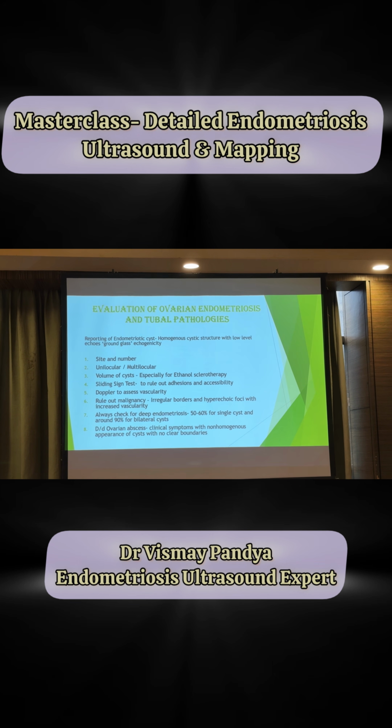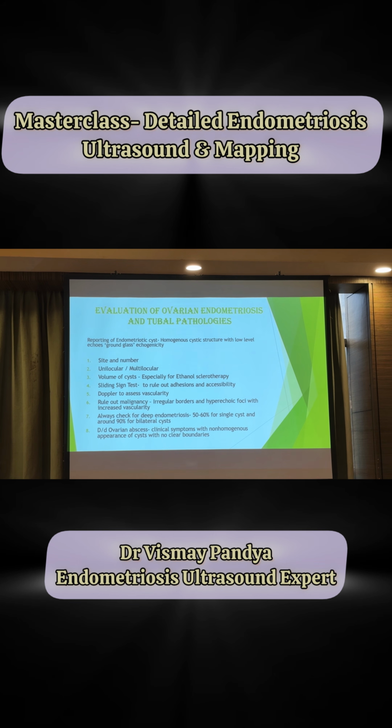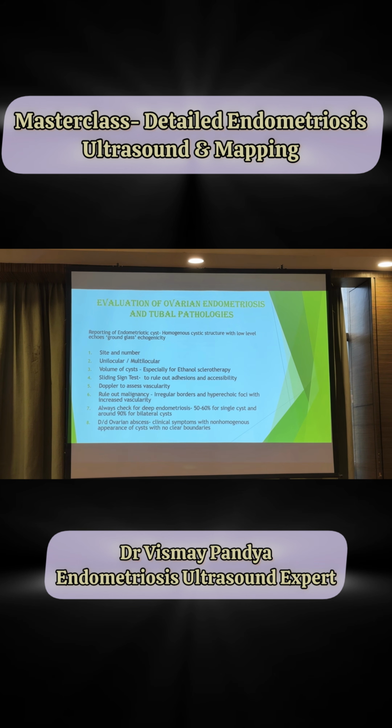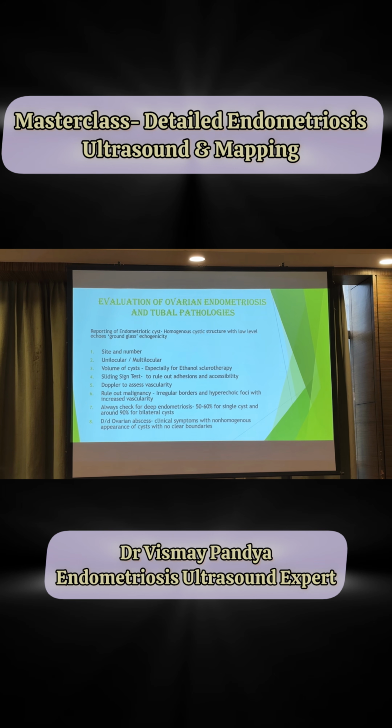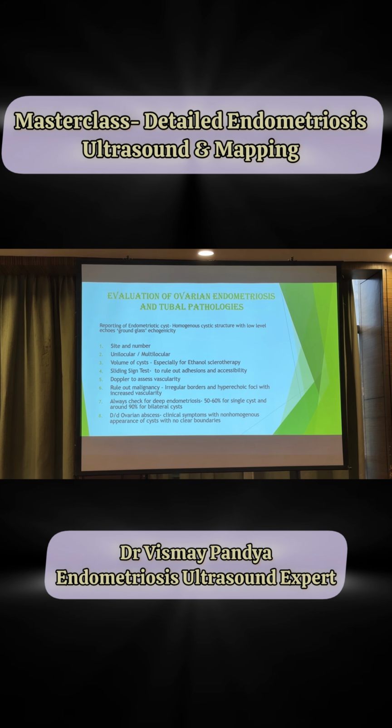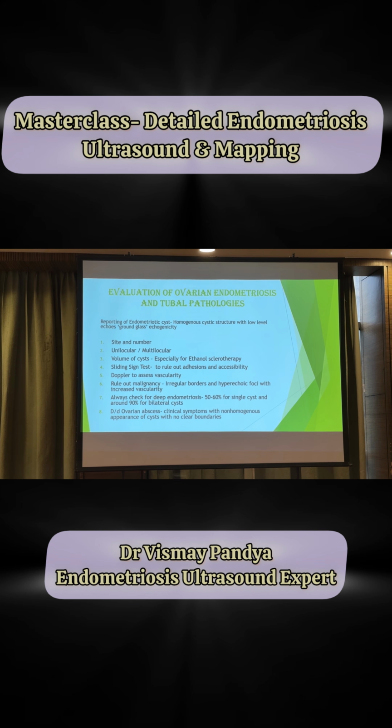The fourth is the sliding sign test. I will come to the sliding sign test a bit later. You need to put a Doppler on every endometriotic cyst to assess the vascularity. Of course, endometriotic cysts are not known to be malignant, but sometimes there is a 1 to 2% chance of it being malignant. So always put a Doppler on the cyst, again to rule out any malignancies.